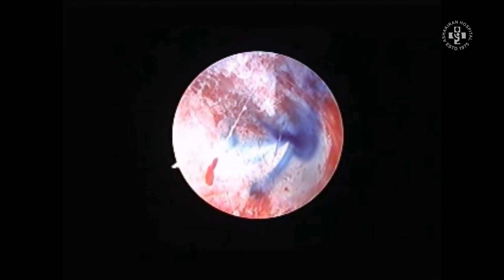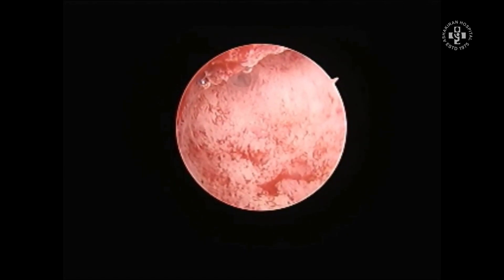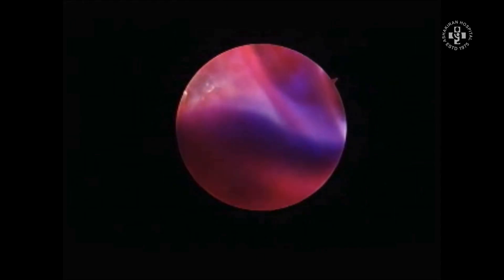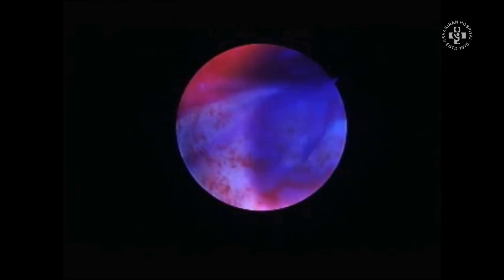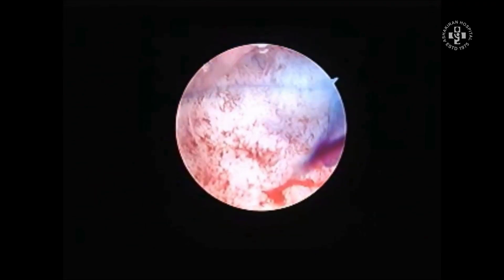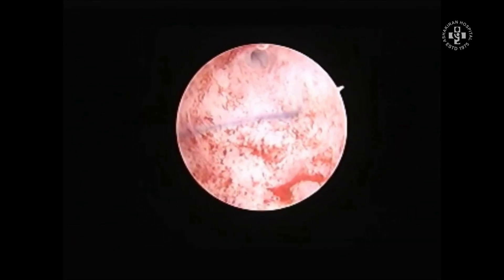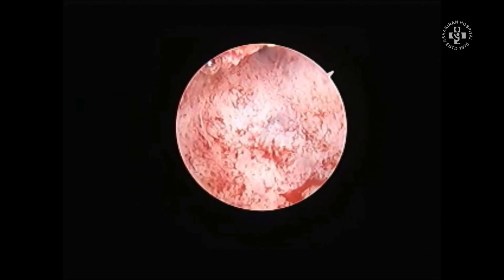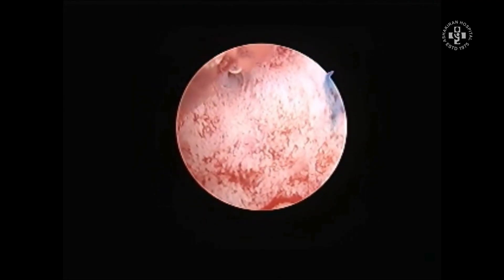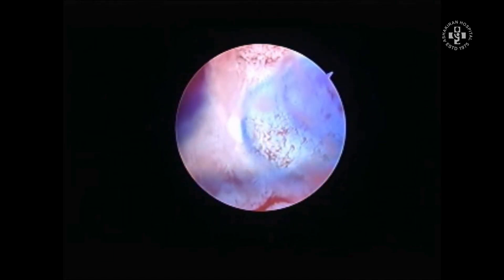This is the magic of hysteroscopy — with a simple instrument like an office hysteroscope, even if the patient doesn't want to go with the HSG, you can document that the tubes are patent. This is the methylene blue test. You have already seen the dynamicity of the ostia by pressure effects, then by bubble testing, and this is the dye test where the dye is pulled up into the ostia into the peritoneal cavity. These are the indirect tests which tell you that the tubes are patent.